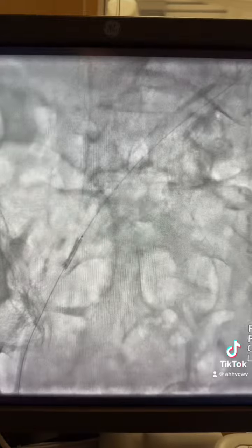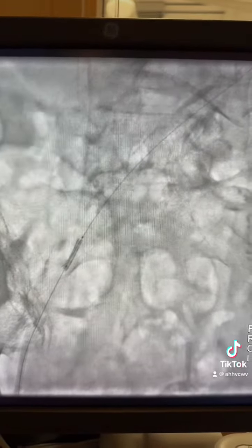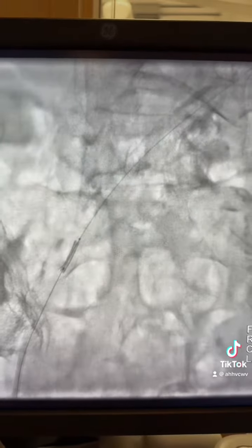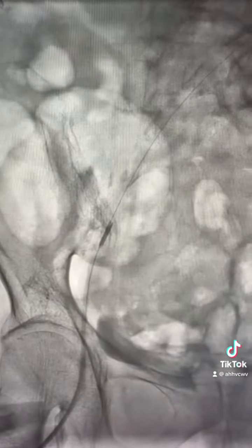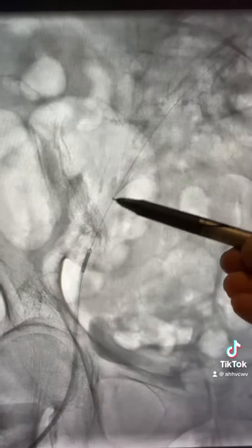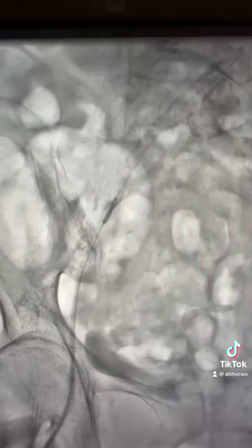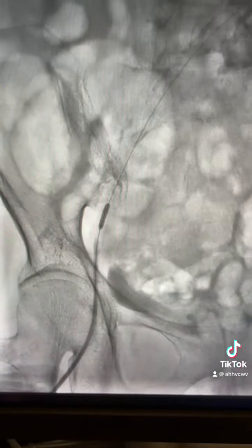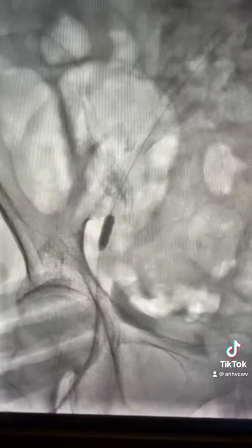A 2.0 coronary balloon was advanced through the stent, as you can see, then inflated at nominal pressure and dragged the stent to the correct location. The stent was dragged at nominal, or 8 atmospheres, from the distal position down to the right location where the lesion is. The coronary 2.0 balloon was then inflated at high atmosphere.